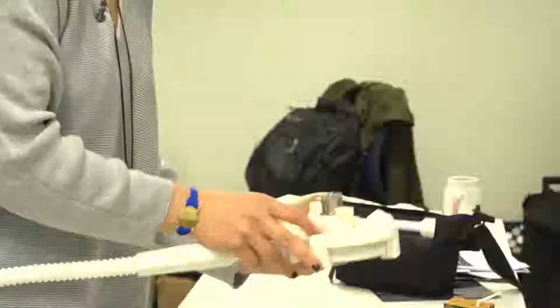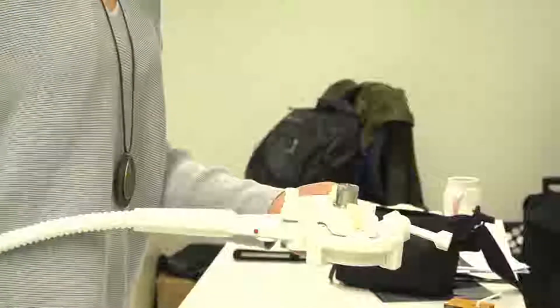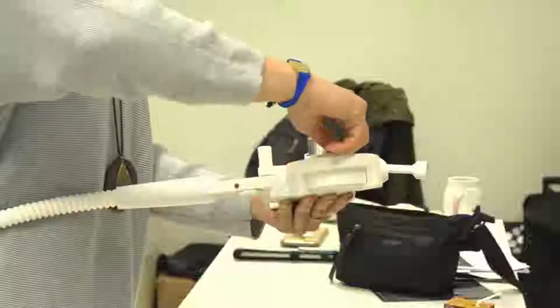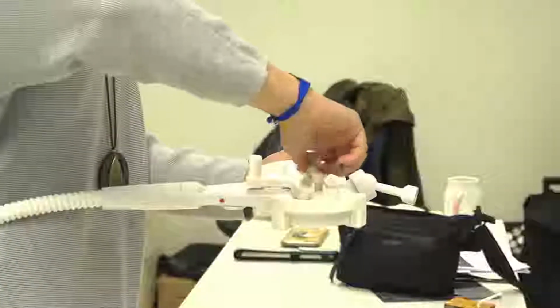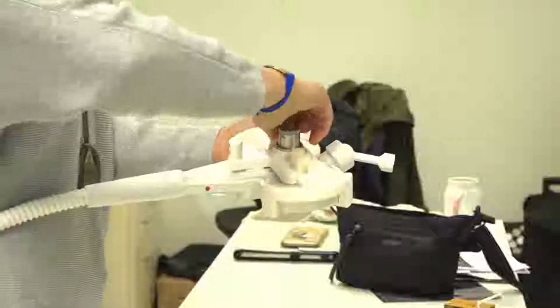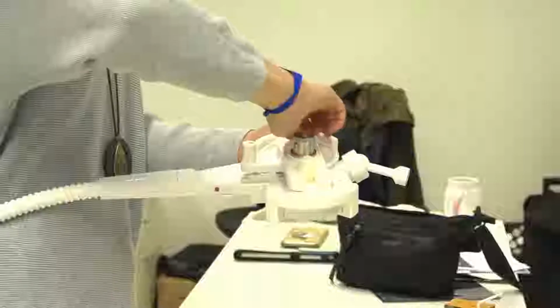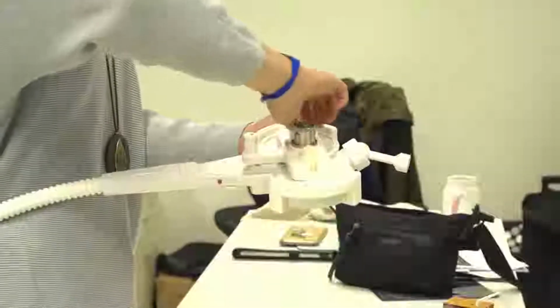And then you want to locate this in the middle. And these will be located in the chin rest. But you can play with it also. You will need to play with it when you're going to do your experiment. I have already tried different ways in the lab where I am now, and you can waste days until you reach a conclusion that probably that method doesn't work and you want another one. So you need to play with it: what is more comfortable, and what is also accurate.